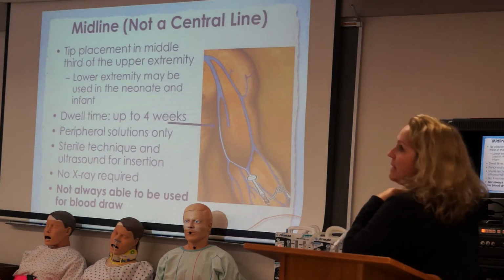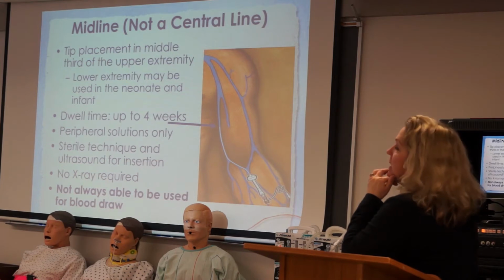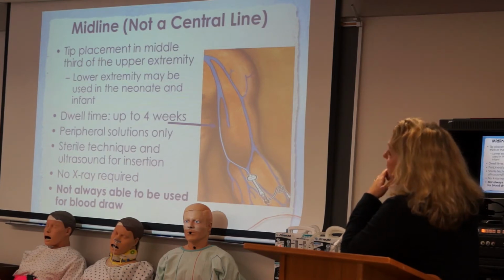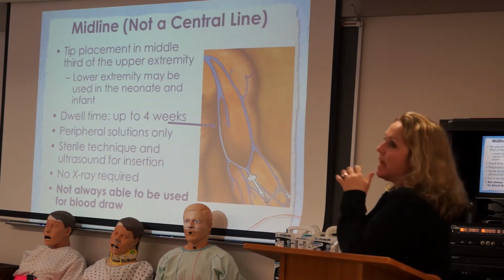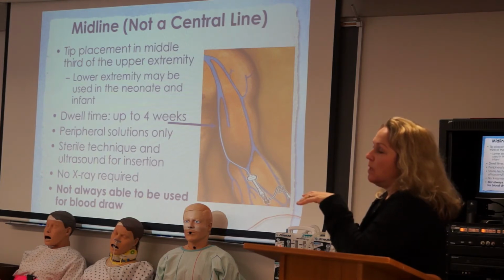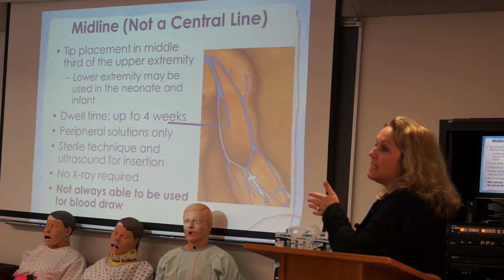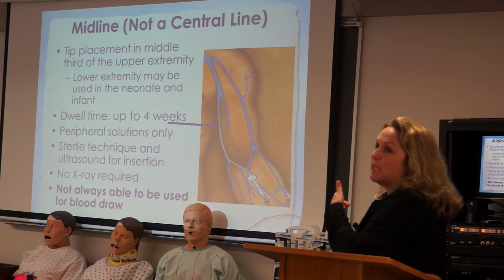All right, midlines. Anybody seen a midline? Nobody? So some facilities have what's called an IV access team or a PICC team, and I used to be on the PICC team. But what they've done is they've, for the most part, taken PICCs, and they've just had the IR staff and the IR physicians put them in. But there are still nurses who do midlines at bedside.